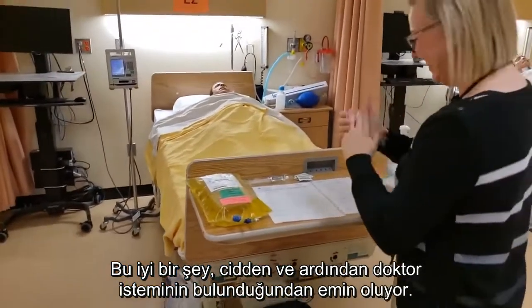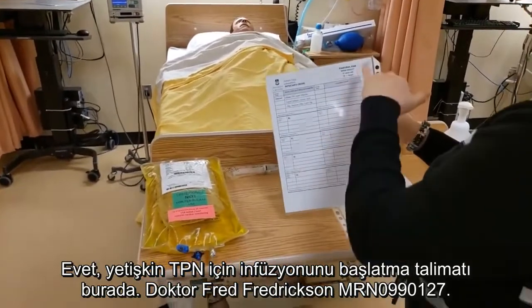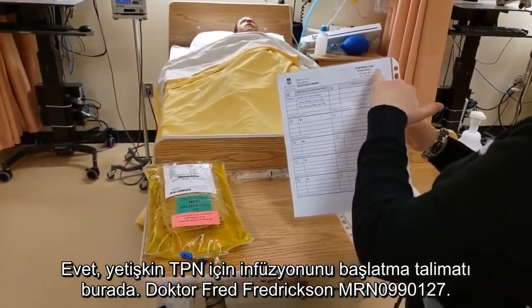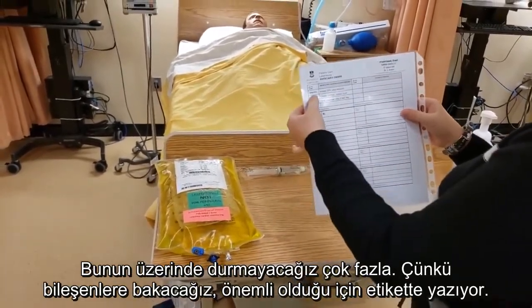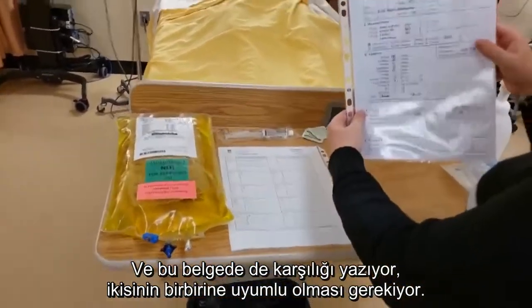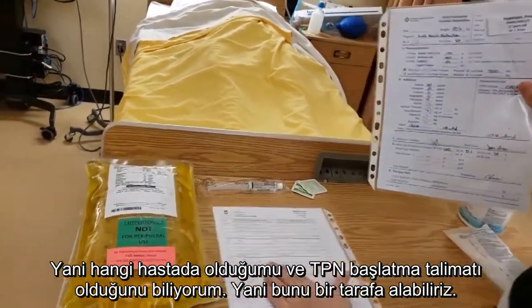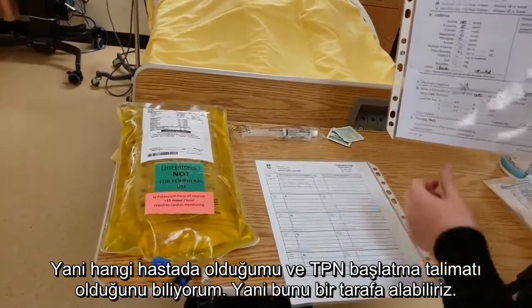The first thing — she's making sure she has an order. So I have my physician's order here for Fred Fredrickson, MRN 099-0127, to initiate TPN adult infusion. The time is noted, but the components are more importantly labeled and outlined here and should match our bag. So I know that I have my correct patient and that I do have the order to initiate TPN.